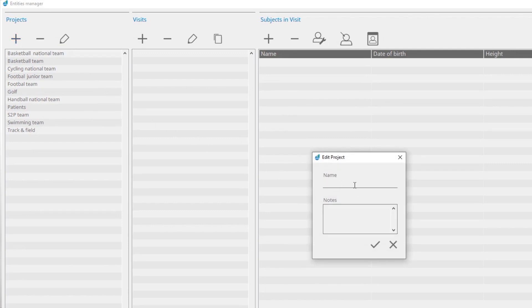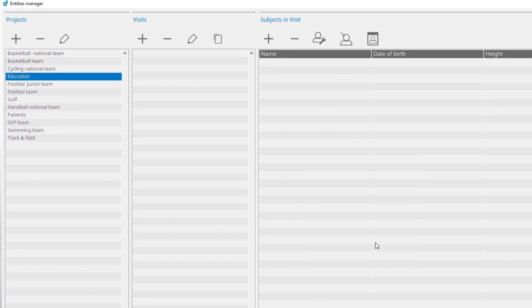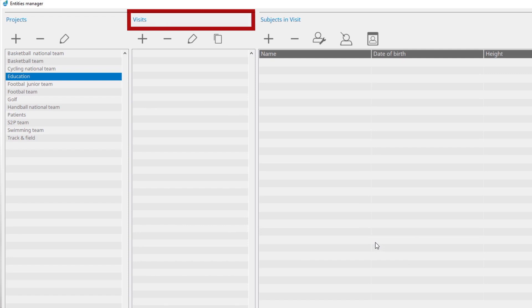Write a name for the project. If necessary, you can add notes. Add a new visit. In the Visit panel, existing visits are listed.